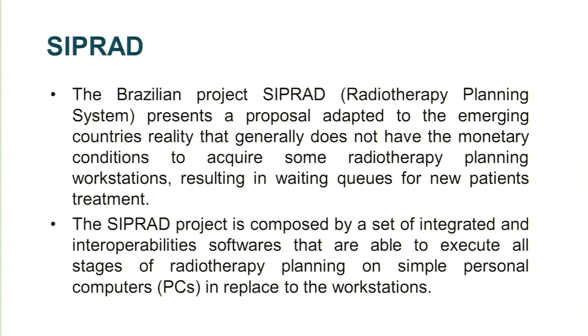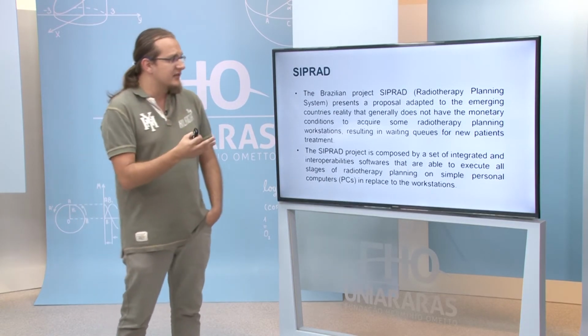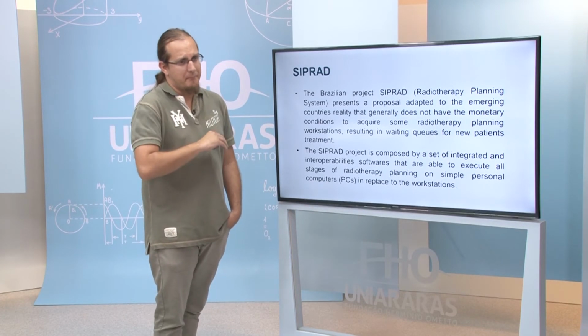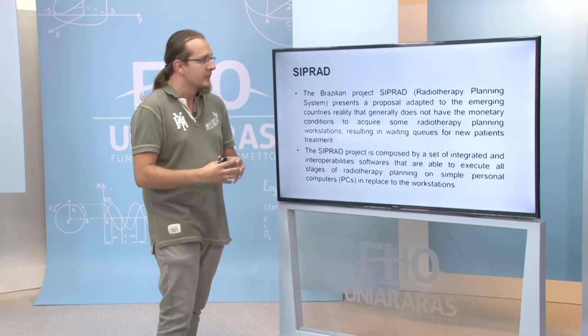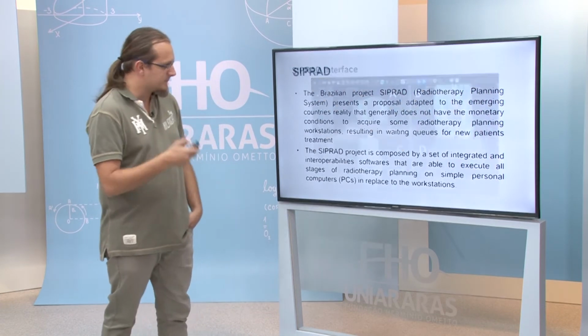The SIPRAD project is composed of a set of integrated and interoperable software that can execute all stages of radiotherapy planning on simple personal computers, PCs, instead of workstations. The work focuses on using parallel computing so that a small PC can process all the data important to big data like this.